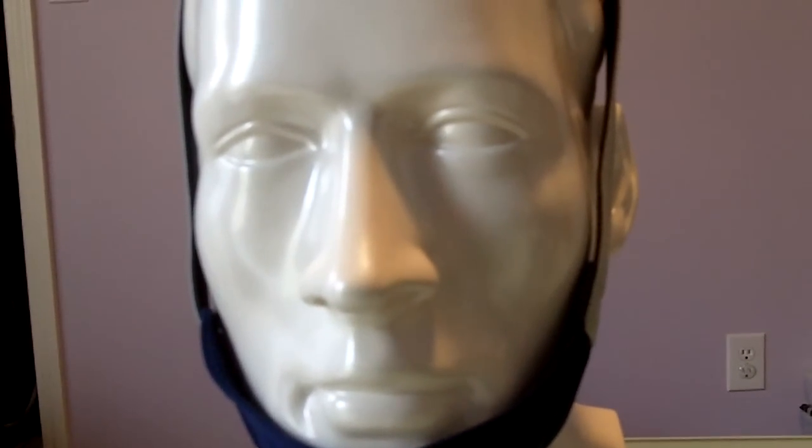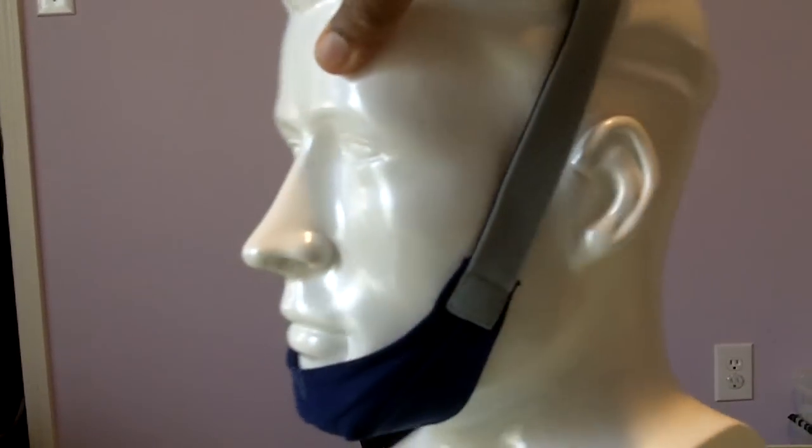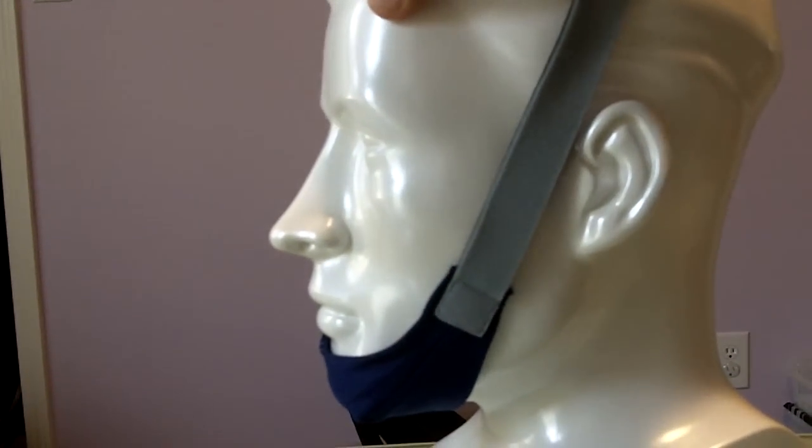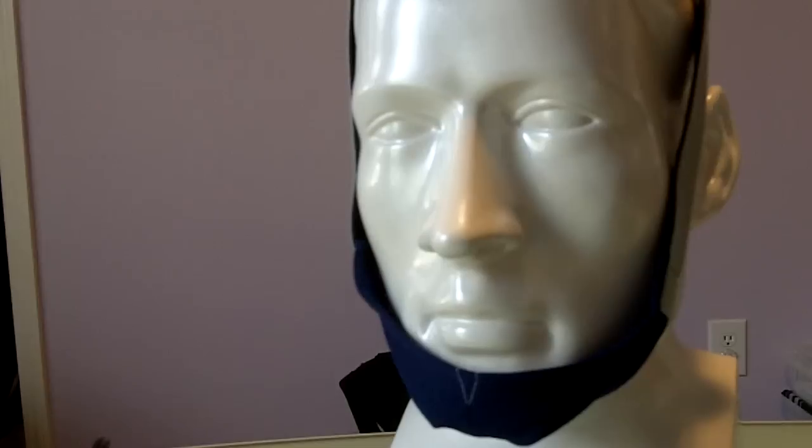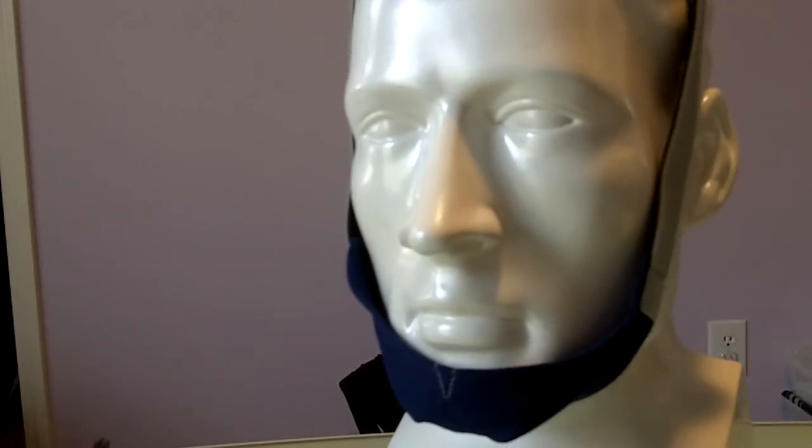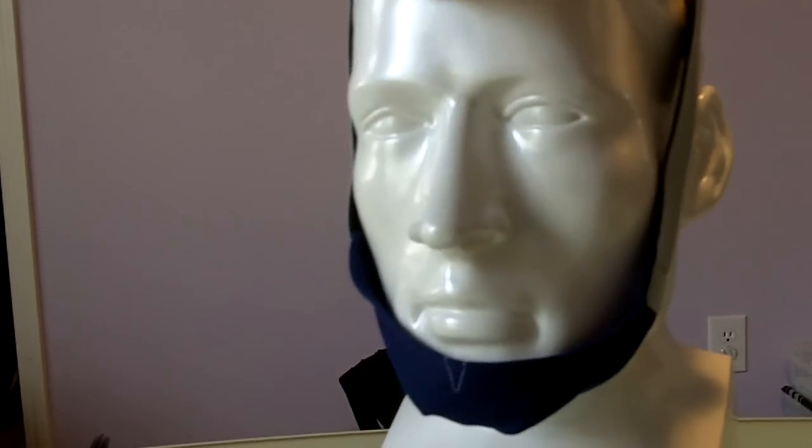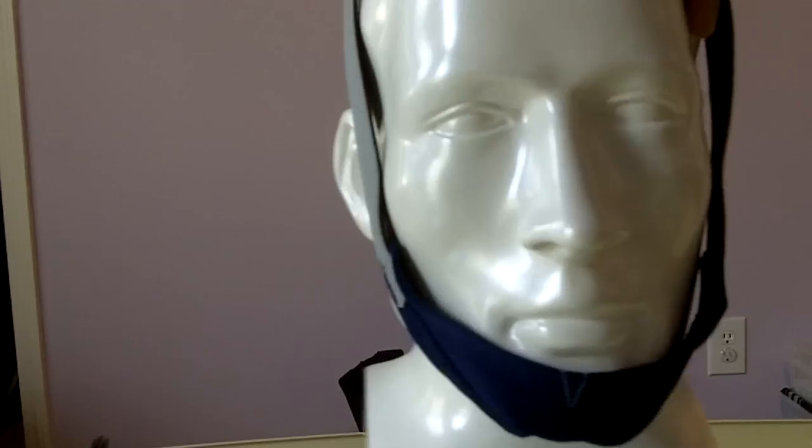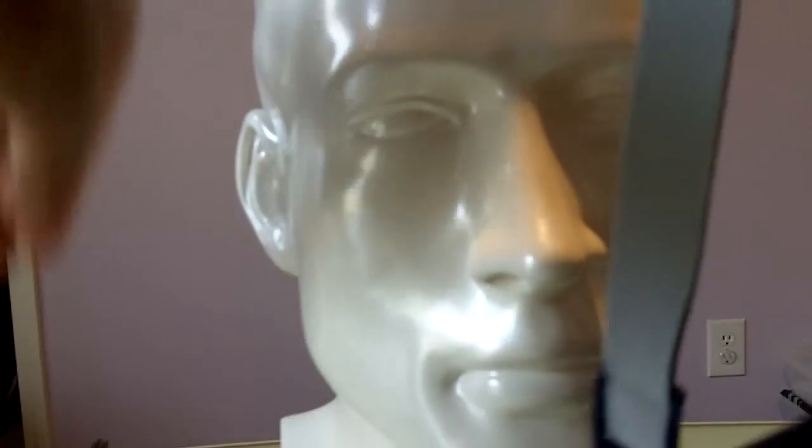This chin strap is one size fits most. I really wish it came in many other sizes. This is good for someone who's claustrophobic because it slips right off easily.